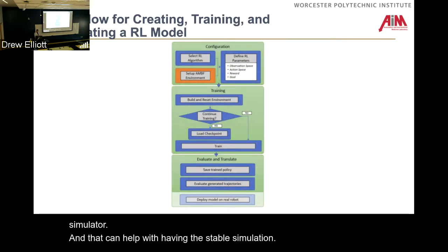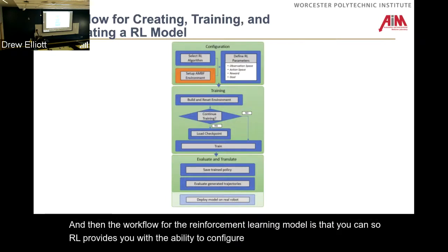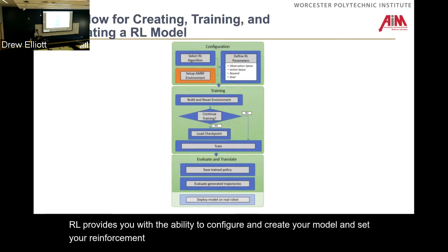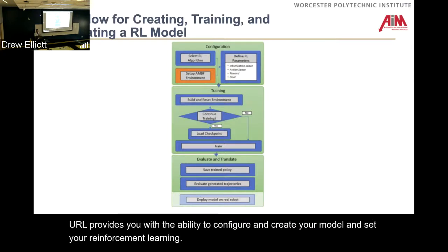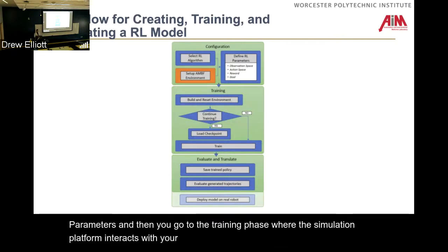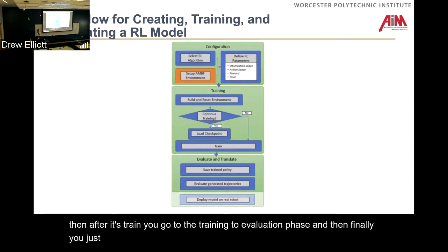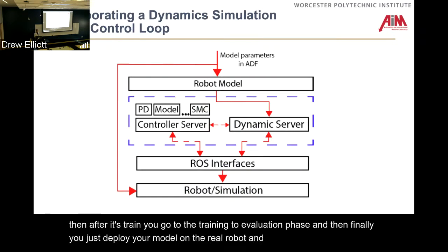And then the workflow for the reinforcement learning model is that ARL provides you with the ability to configure and create your model and set your reinforcement learning parameters, and then you go to the training phase where the simulation platform interacts with your objects, uses the algorithms to train the model, and then after it's trained, you go to the evaluation phase, and finally you just deploy your model on the real robot and test it.